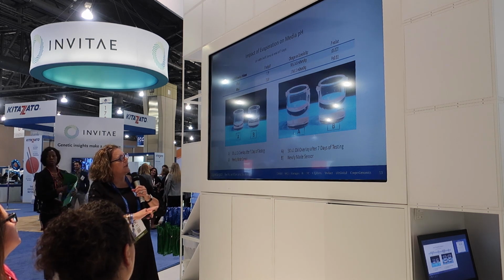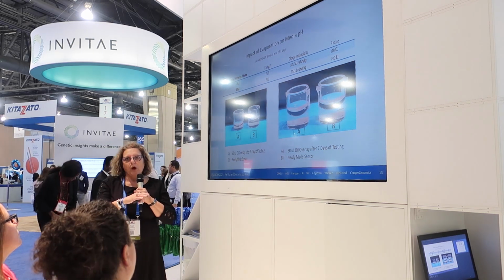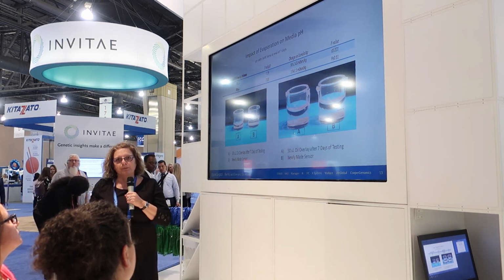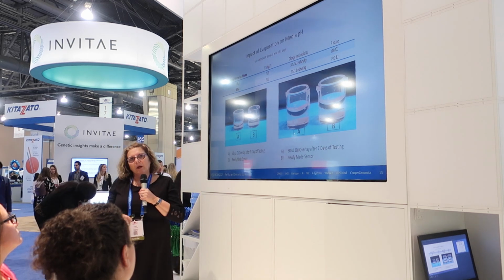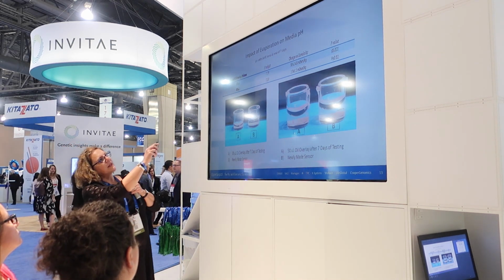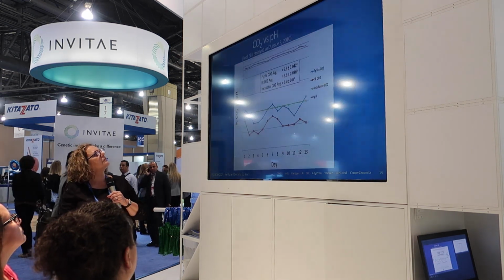Just having less oil overlay, it really is drying up the drops. As if you're putting even more, just 15 microliters more. These are small cups, but even 15 microliters more just really makes a change in your osmolarity and final pH.